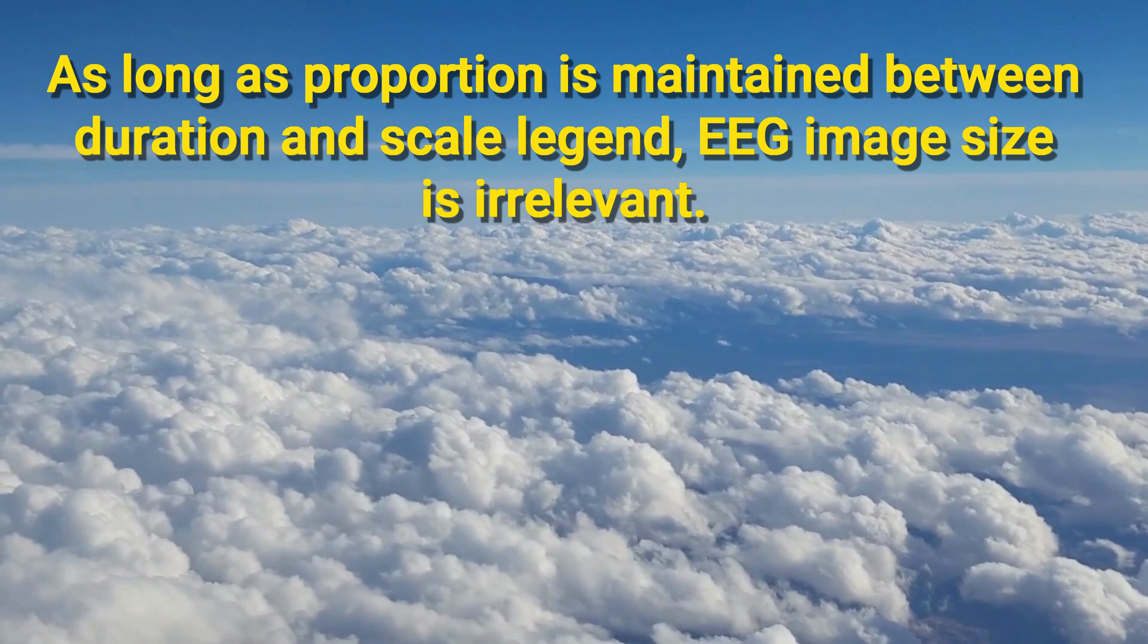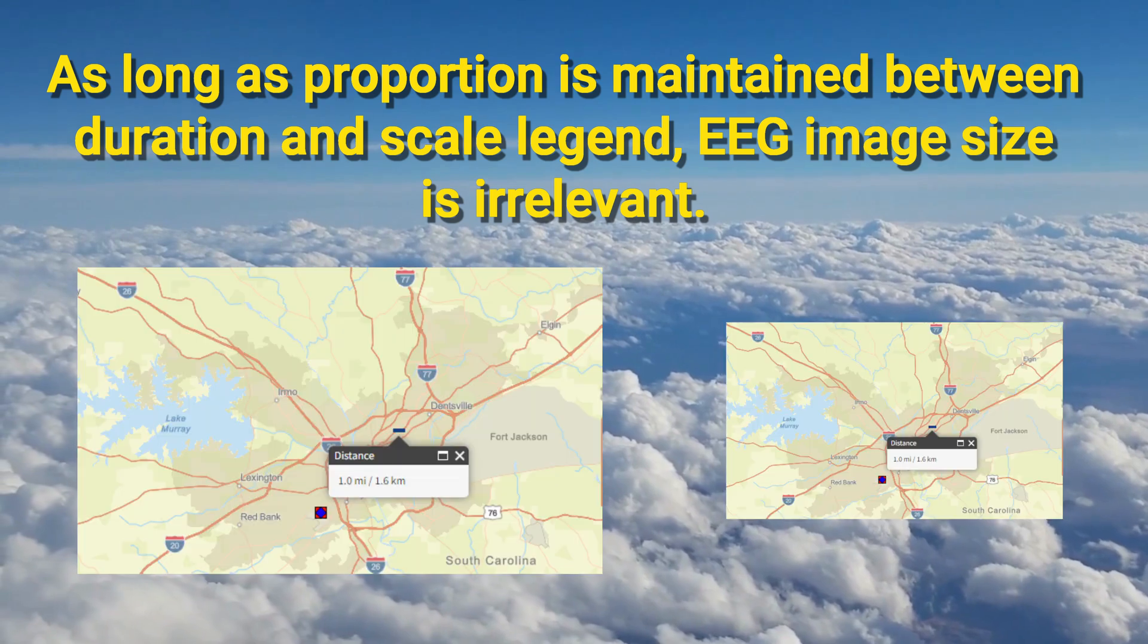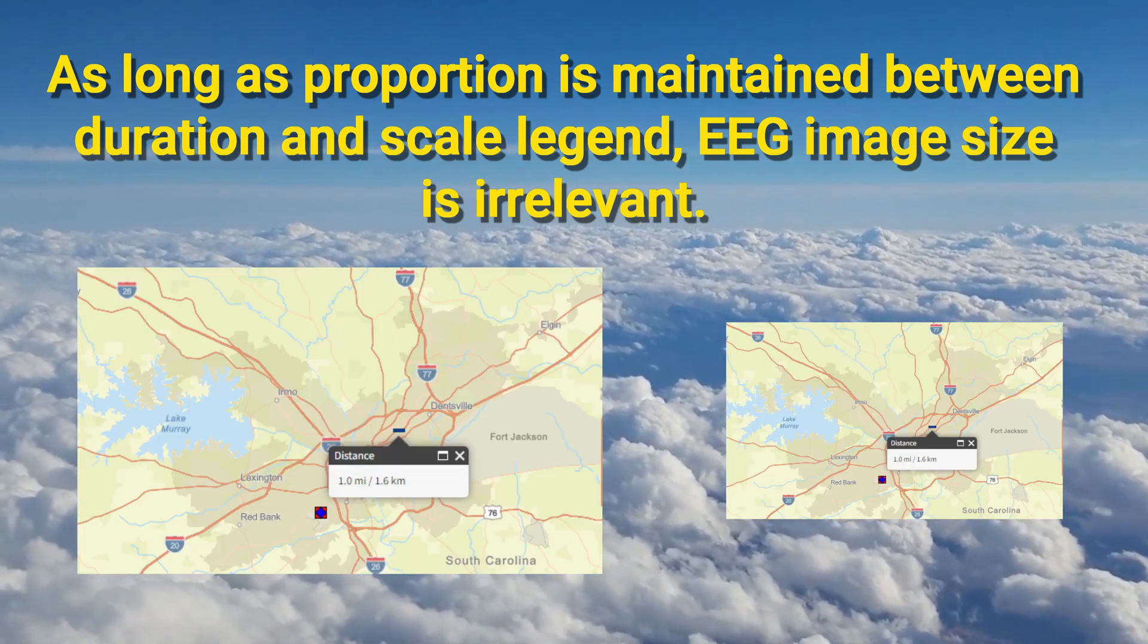You can change the size of that as long as the proportion stays the same. That is, the width and the height, the ratio of those to each other stays the same. If you reduce the size of an EEG image, yes, the scale legend is going to be less width and less height, but the wave you're measuring is proportionally going to be less.